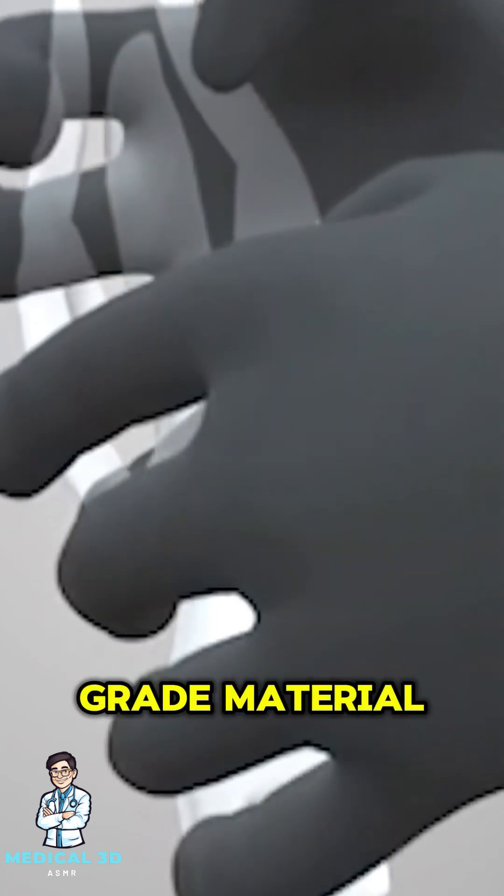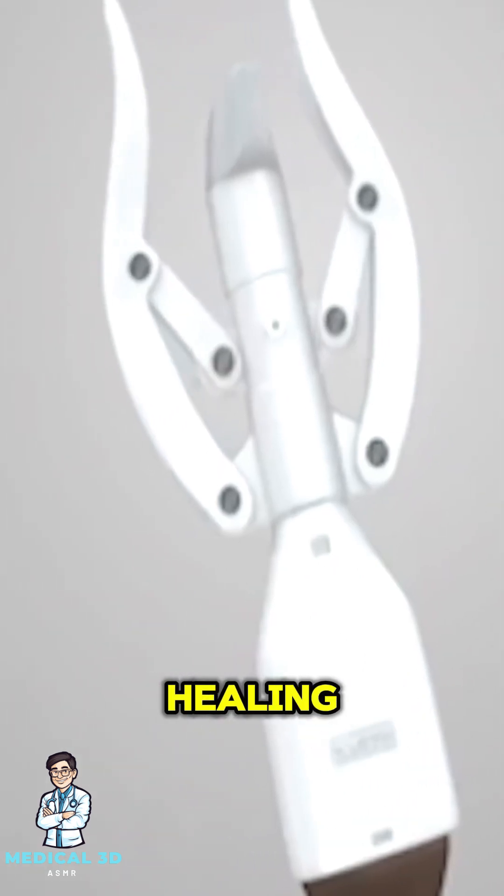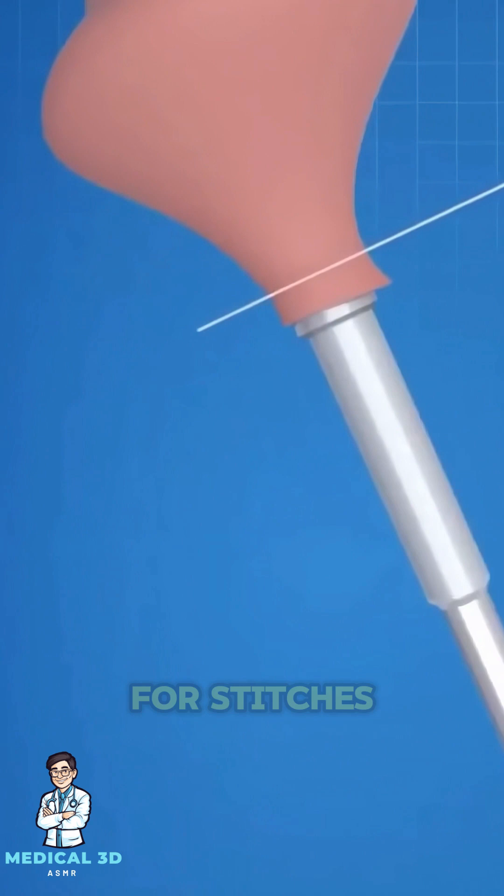The staples, made of medical-grade material, minimize bleeding and aid in faster healing. The procedure typically takes just a few minutes with minimal discomfort and no need for stitches.